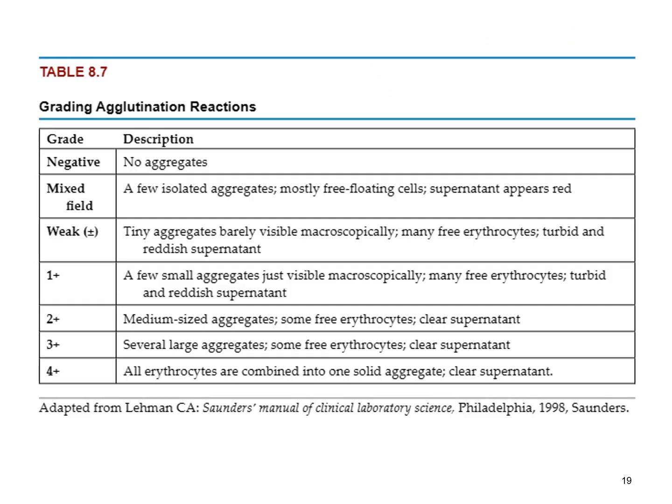Agglutination reactions are graded, so the degree to which we see that agglutination happen is what we score it at. Sort of like in hematology, as well as urinalysis, where we had to grade the morphology of the red cells, as well as the amount of something that was present in the urine. We do the same thing when we're grading these agglutination reactions. We're going to walk through them briefly, but I'm not going to go into a whole lot of detail because, once we hit blood bank, we're going to focus on this a lot. So you will become very familiar with these reactions and what they mean.